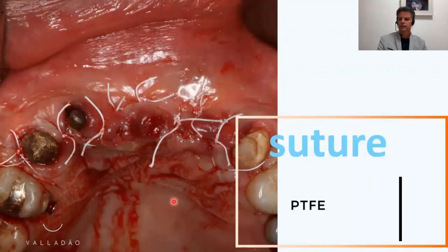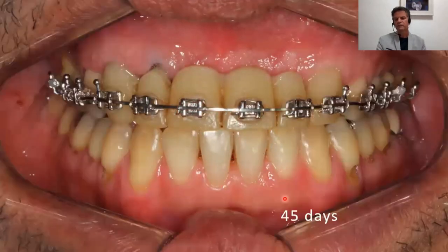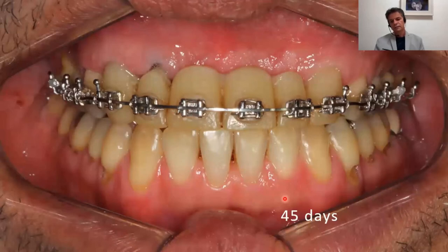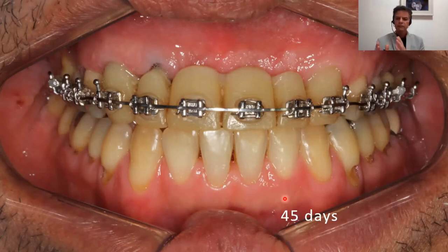A particularly important step is the release of the flap to obtain passive closure without tension. This is the final aspect with the PTFE suture in place. This is the 45-day clinical view. I evaluate my patients undergoing GBR procedures on a weekly basis in the first month, and then every month until completing a nine-month period of graft maturation.